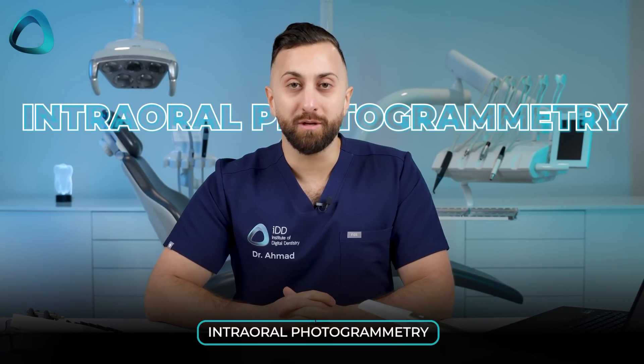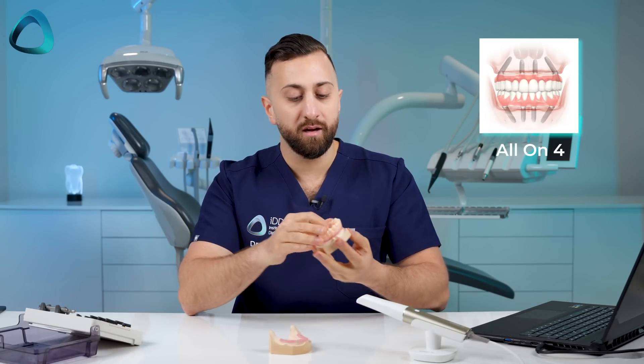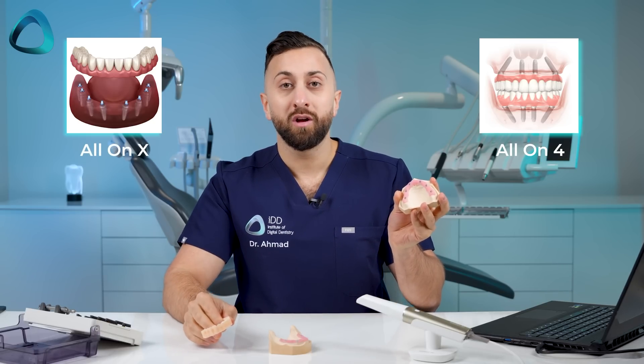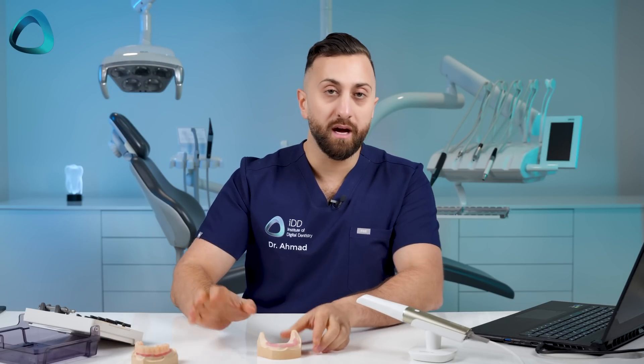One of the main features of this scanner is intra-oral photogrammetry. What I wanted to do in this video is show you how that actually works. I have a few models — here's an all-on-4 and an all-on-x model.